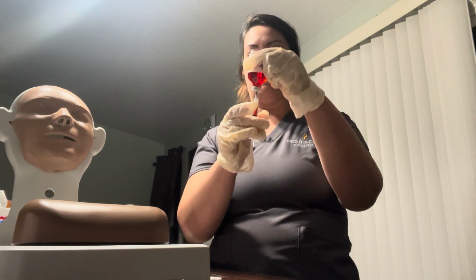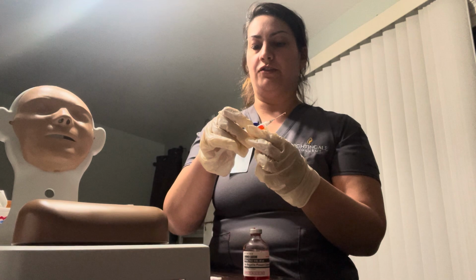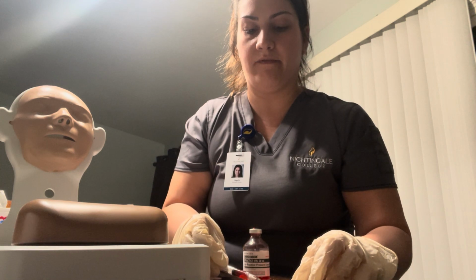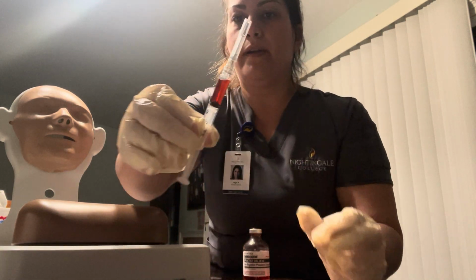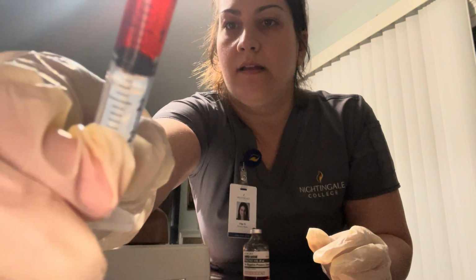In this case, there are no bubbles. I will take it out, and I will show you guys that it's 1.5. I will do a 1 scoop method before I show you guys. There we go. And so now I will show you that it is 1.5 mLs. You guys can see that. Okay. There we go.